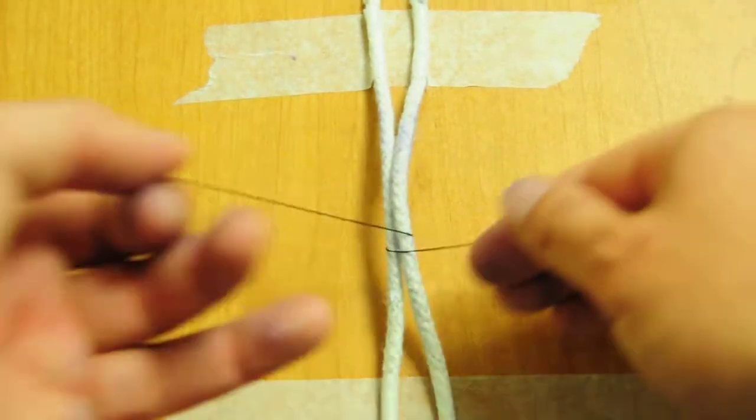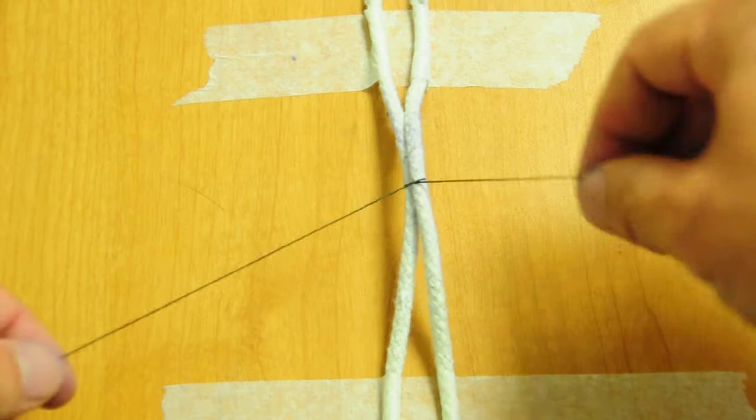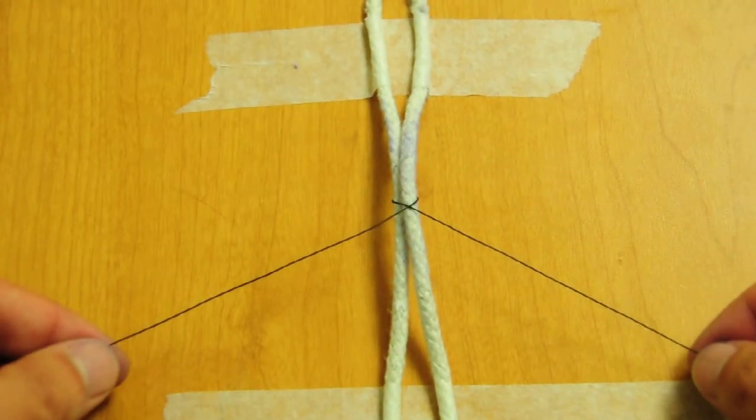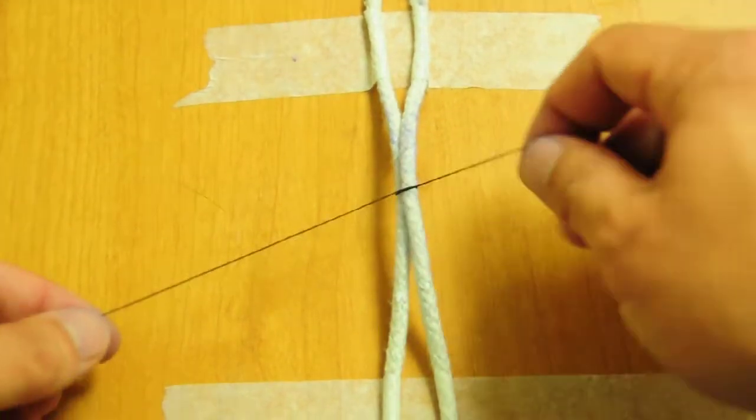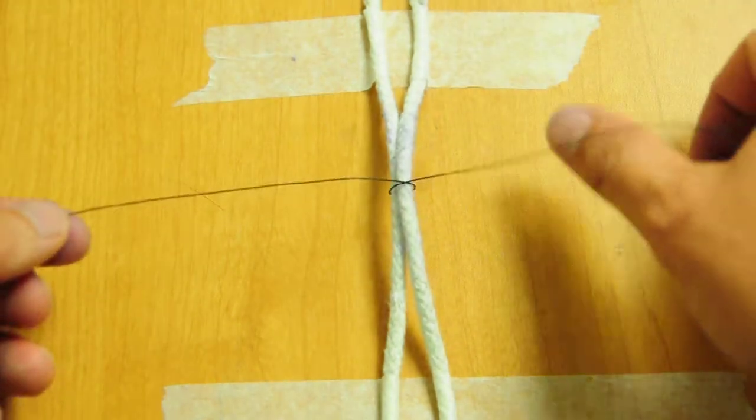So say you're doing your two-handed ties. This is where the importance of the surgeon's knot comes down. It helps cinch down your first knot. So we're going to take it here.